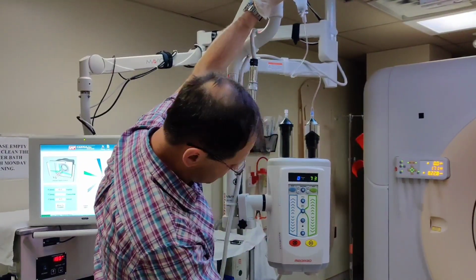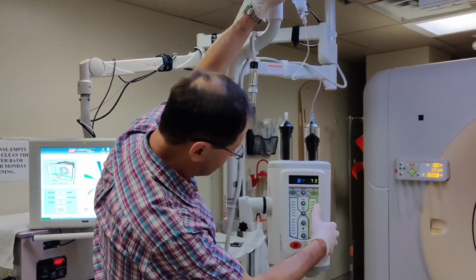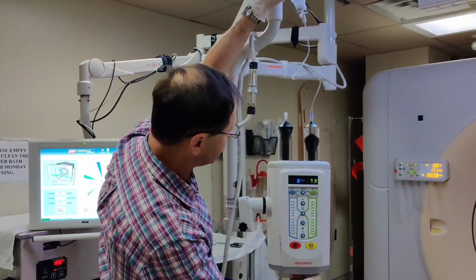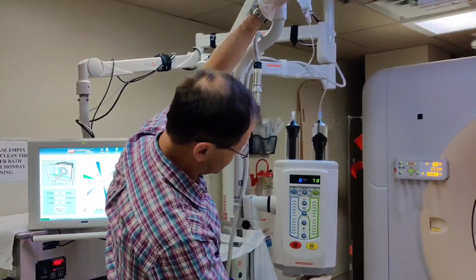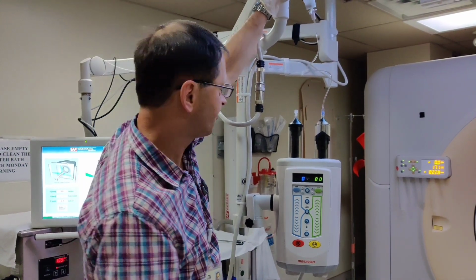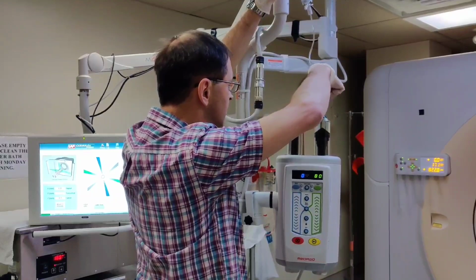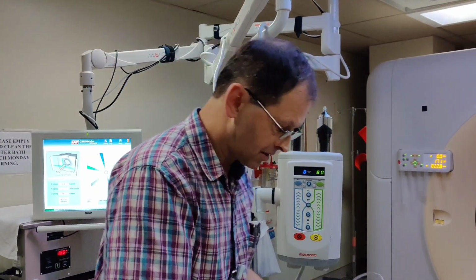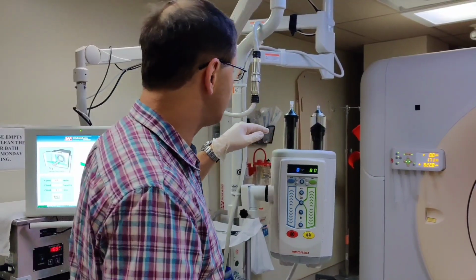See, I'm doing this by rotating the knob at the bottom. I could also use the button here or the slide panel here to draw more. My personal preference, I just turn the adjuster on the bottom. So 80 should be sufficient. Then I'll disconnect. Set that aside. Likewise, I need to do the same thing with the saline.